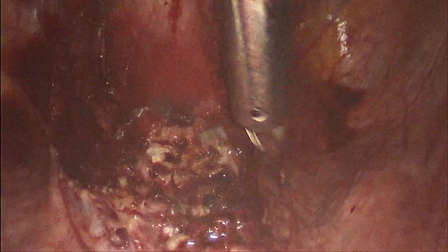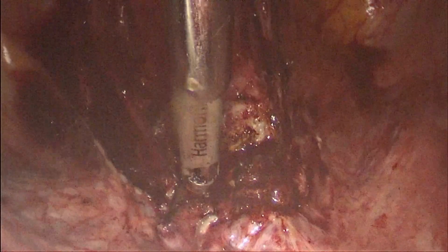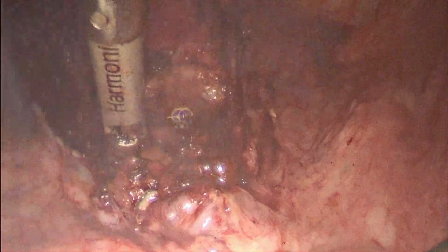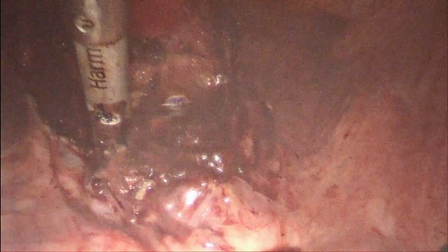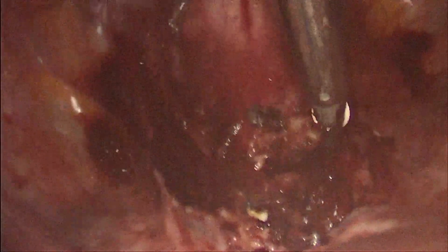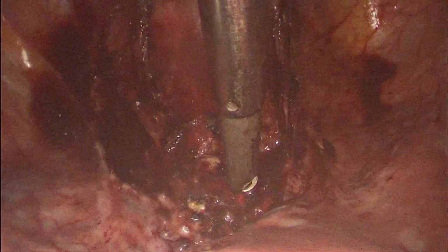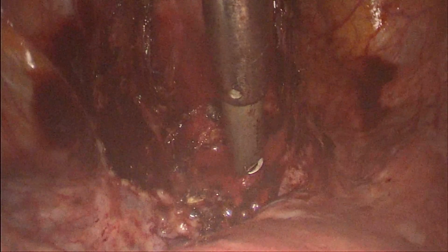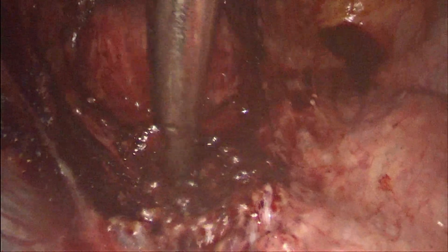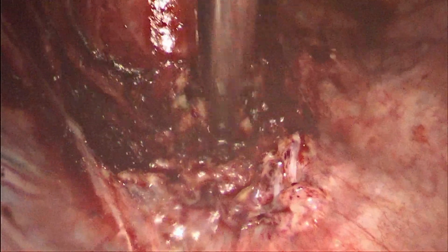This is the lower segment, at the junction of the cervix and the uterus, near the isthmus. In the central area, we made an incision. Nearly half a centimeter incision is made, which is extended. So now we are aspirating the contents with the suction sleeve.